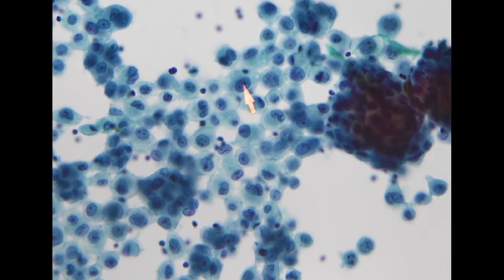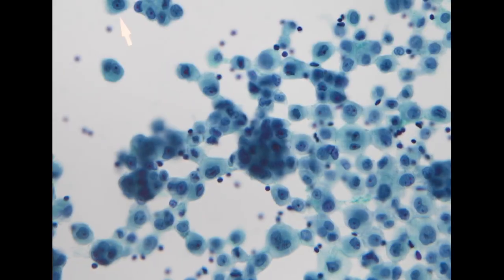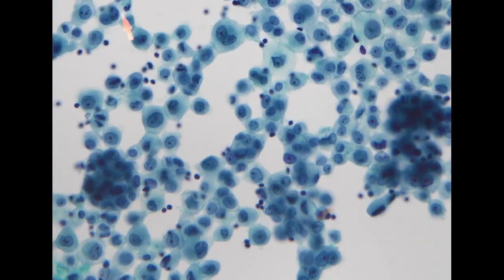And so the first clue that we have is hypercellularity. The second clue is frequent binucleation. Binucleation can be present in a reactive process, but if you see hypercellularity plus binucleation, this gives suspicion for mesothelioma.